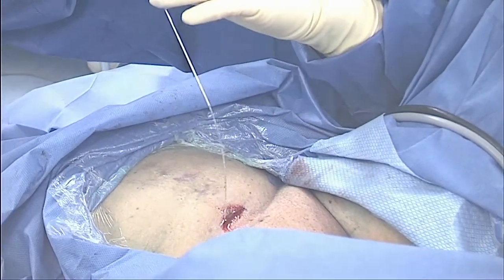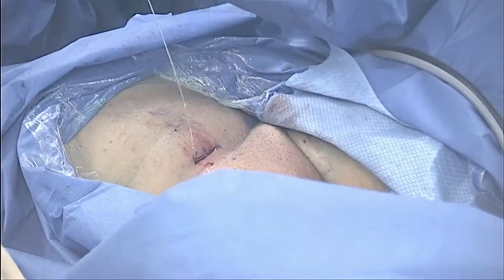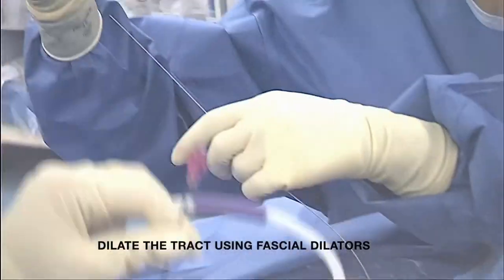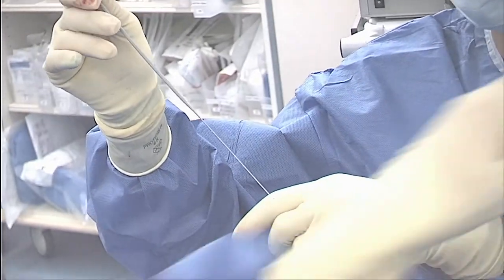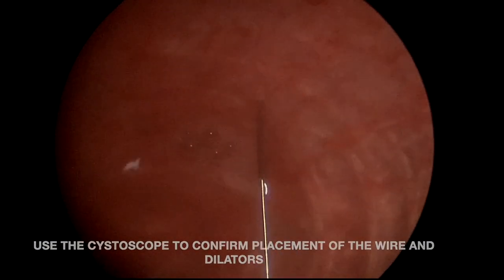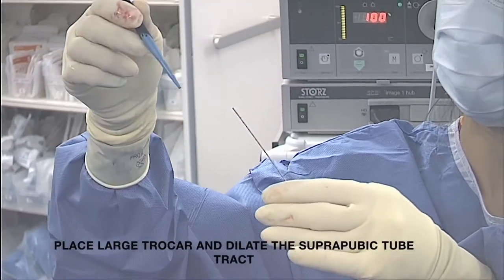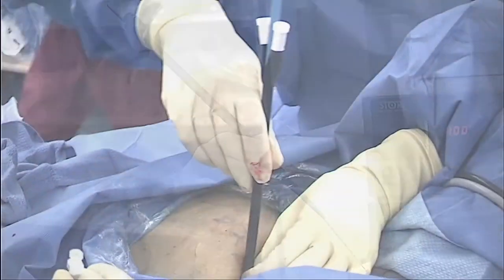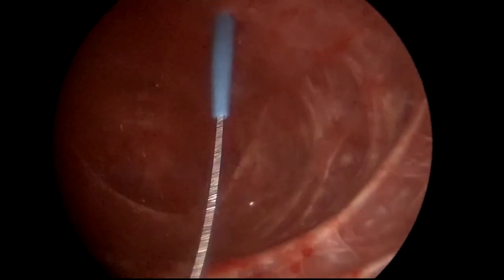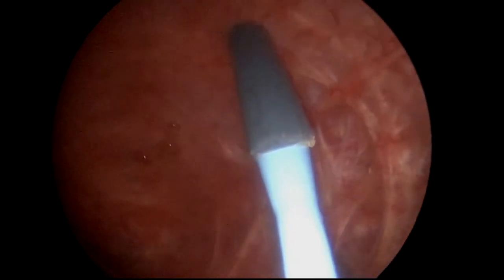Now that we have established access, we can remove the spinal needle. Next, dilate the tract using fascial dilators. We can again use the cystoscope to confirm the placement of our instruments, in this case, the wire and the dilators. Use the large trocar to dilate the suprapubic tube tract. Firmly place the dilator into the bladder and then confirm the placement using the cystoscope.